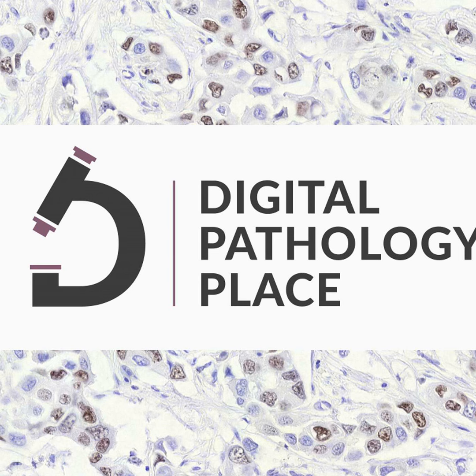So why am I saying a computerized system here? Because a digital pathology system is a computerized system. So basically, this guidance that we're going through is telling us how to deal with whole slide images as a computerized system, and how to apply whole slide images to what is already written in 21 CFR Part 58. Part 11 is for computerized systems.